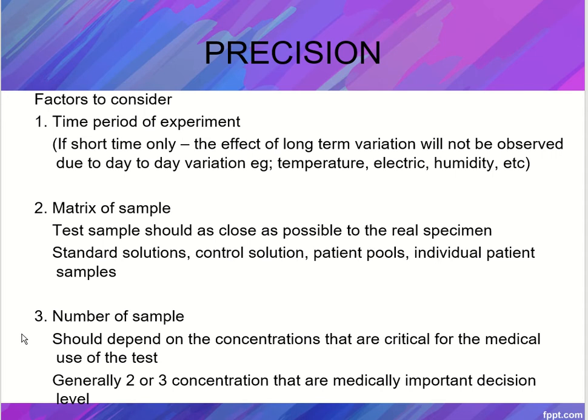Third, number of concentrations. It should depend on the concentrations that are critical for the medical use of the test. Generally, we use 2 or 3 concentrations that are medically important decision levels.